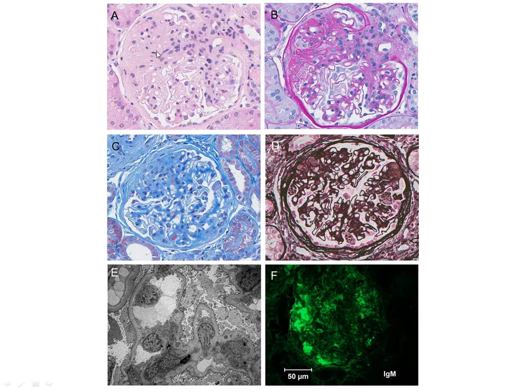There is associated mild mesangial hypercellularity. I think you guys can see my arrows here on the H&E. There's like 5 mesangial cells. And when we see more than 3, then we get a little concerned that there's mesangial hypercellularity. But please remember, mesangial hypercellularity is very nonspecific.